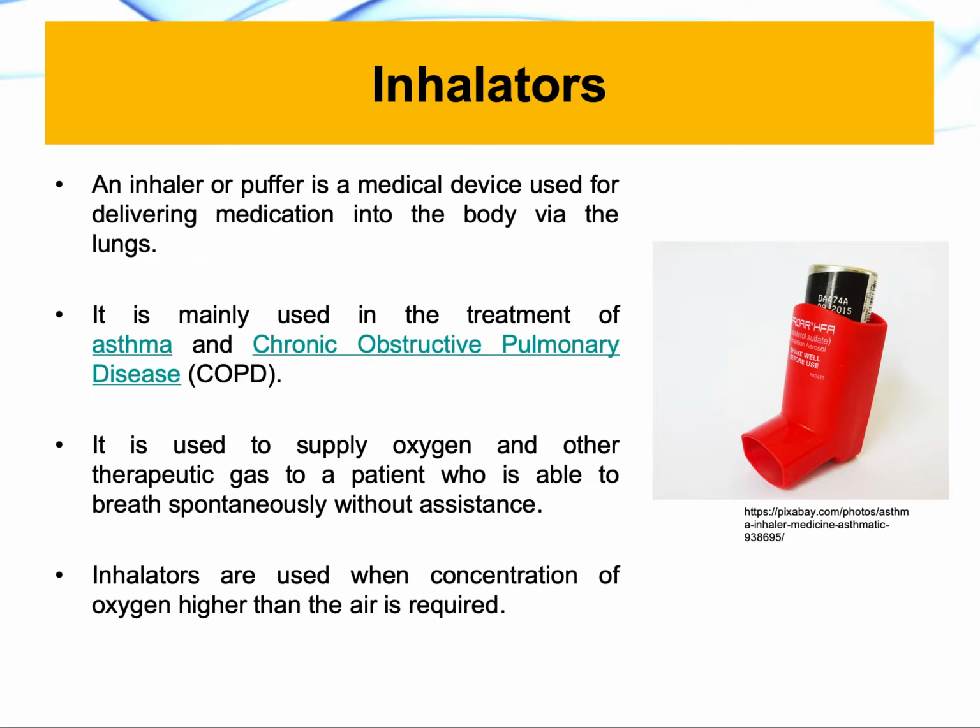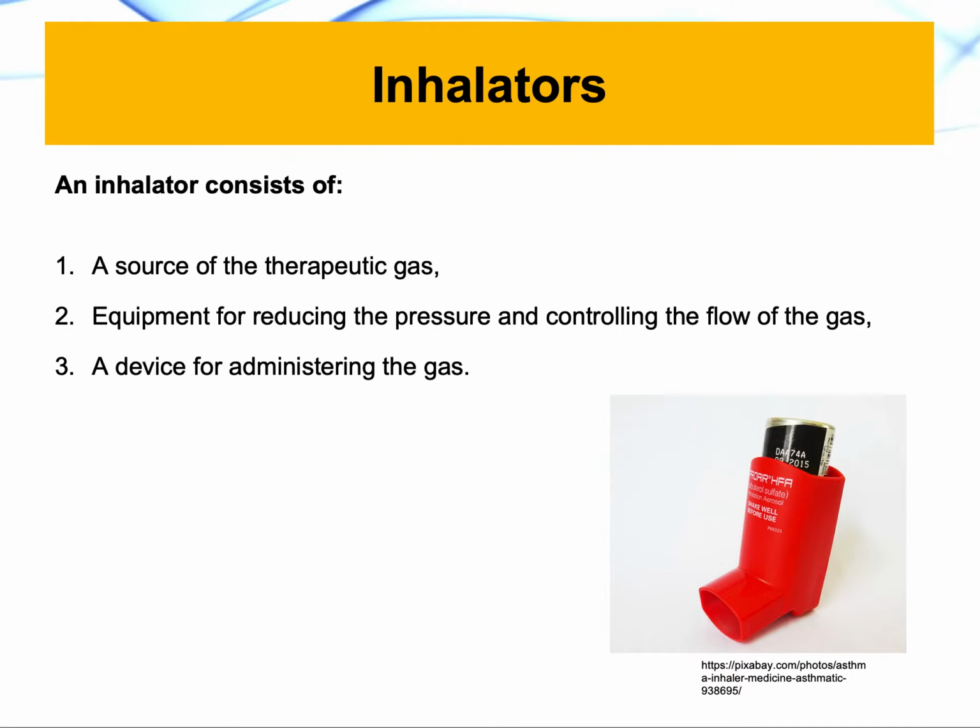So I just wanted to make sure that we are on the same page when it comes to where we use inhalators and why we use them. Mainly it is used to supply oxygen and other therapeutic gases to a patient who is able to breathe spontaneously without assistance, and that's one of the important conditions about using inhalators. They are used when a concentration of oxygen higher than the surrounding air is required for the patient or the subject.